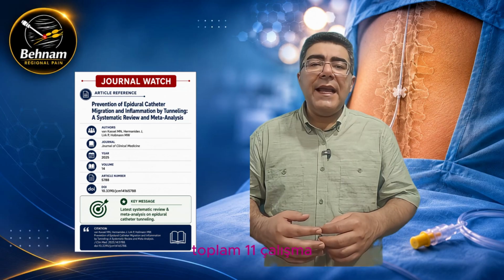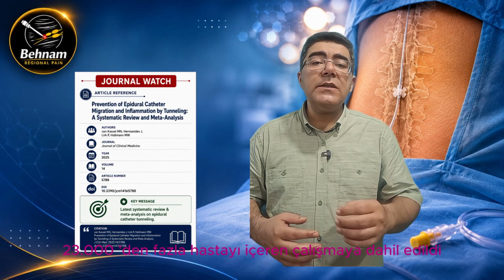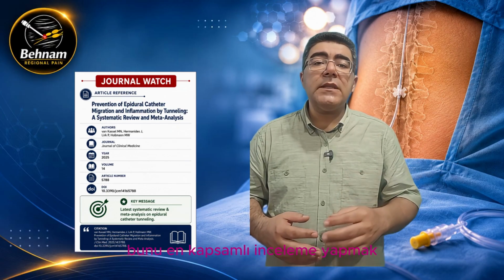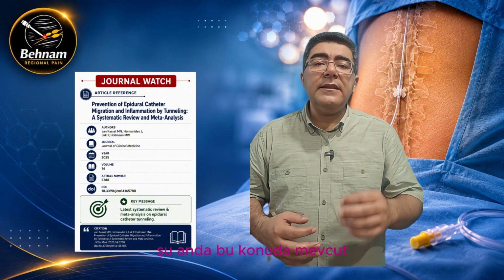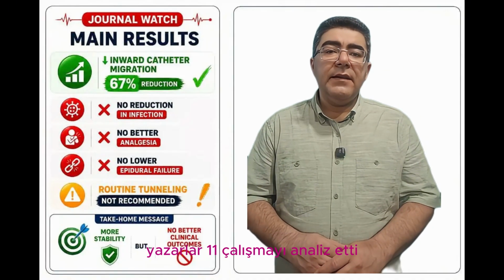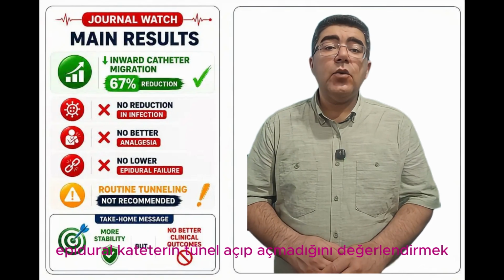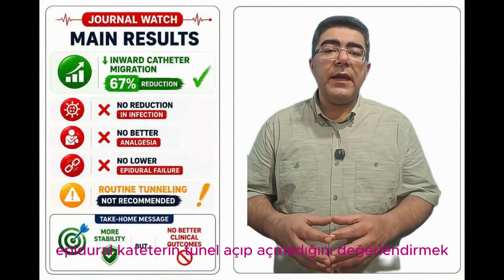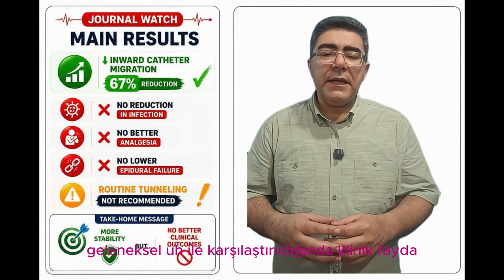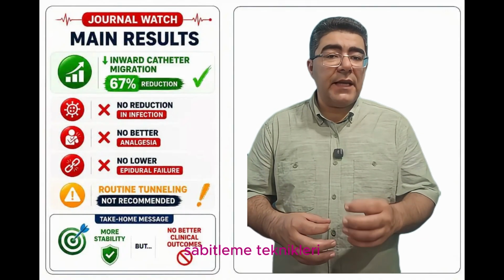A total of 11 studies involving more than 23,000 patients were included, making this the most comprehensive review currently available on this topic. The authors analyzed these studies to evaluate whether tunneling of epidural catheter provides meaningful clinical benefit compared with conventional fixation techniques.